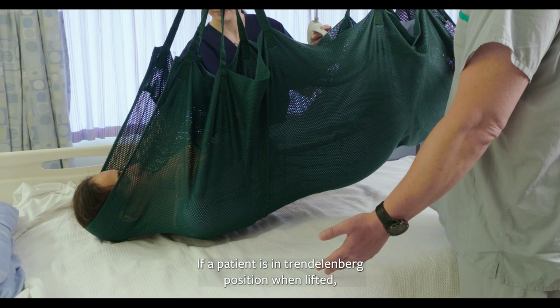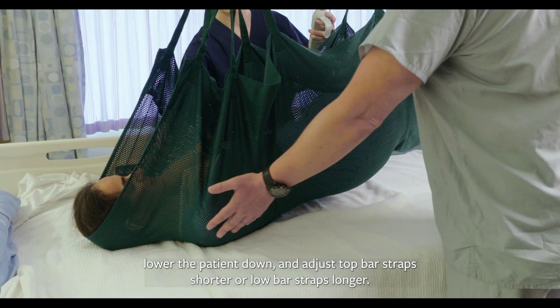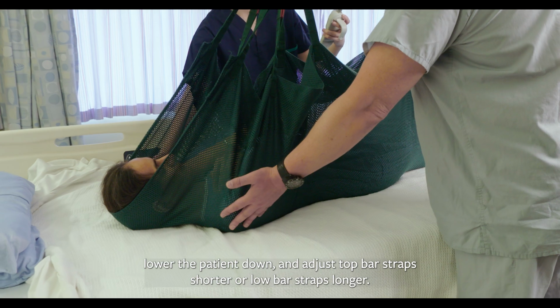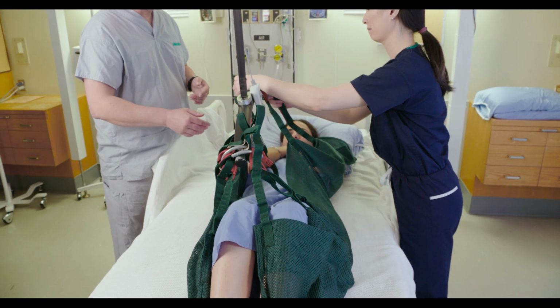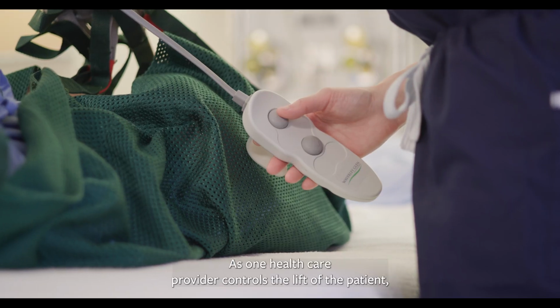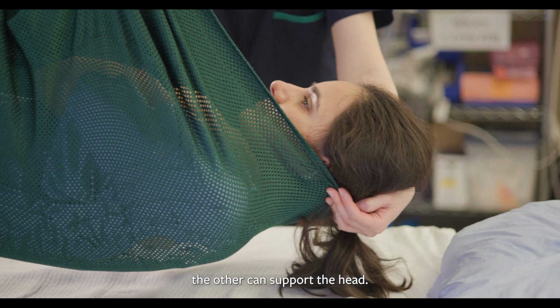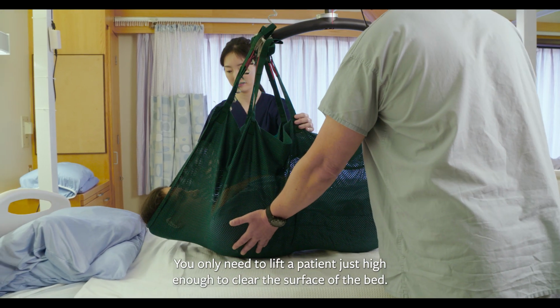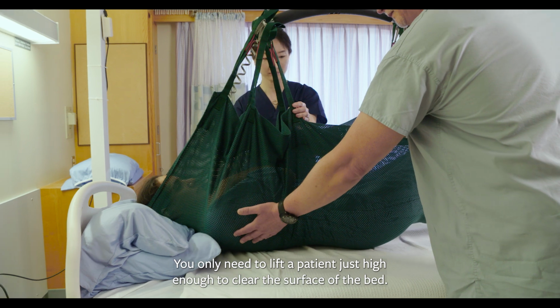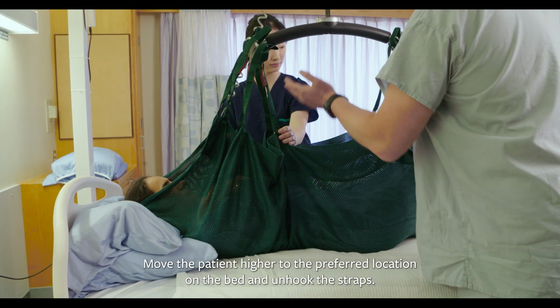If a patient is in Trendelenburg position when lifted, lower the patient down and adjust top bar straps shorter or low bar straps longer. As one healthcare provider controls the lift of the patient, the other can support the head. You only need to lift the patient just high enough to clear the surface of the bed. Move the patient higher to the preferred location on the bed and unhook the straps.